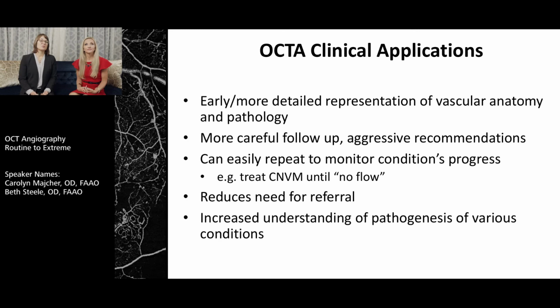So how exactly can we use OCT angiography clinically? What are the applications for the primary care optometrist? We're going to be focusing on several of these things as we get into the cases that will follow. But what you've already been able to see is that we're going to see early and in many cases much more detailed representation of the vascular anatomy and even pathology.